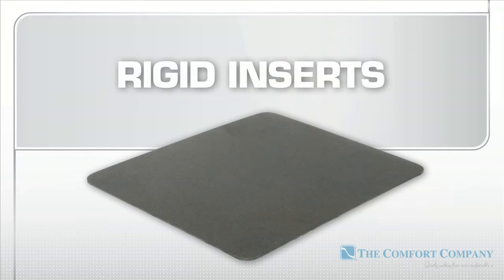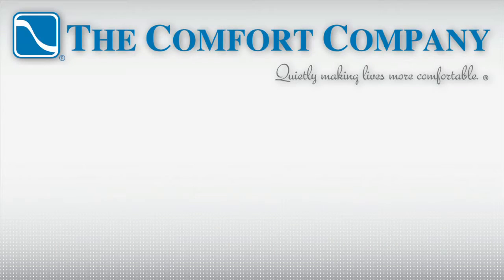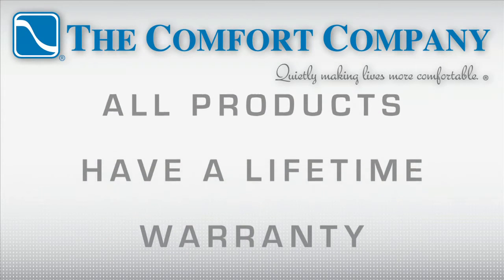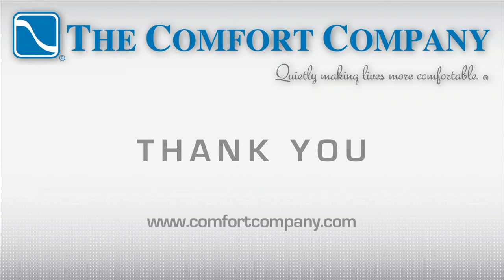Rigid inserts and extra incontinence protection liners are available separately. Each one of our products comes with a lifetime warranty against manufacturing defects, so you can always buy with confidence from us here at The Comfort Company.